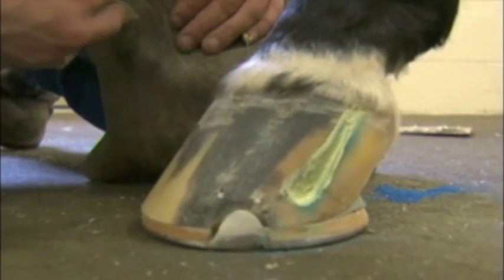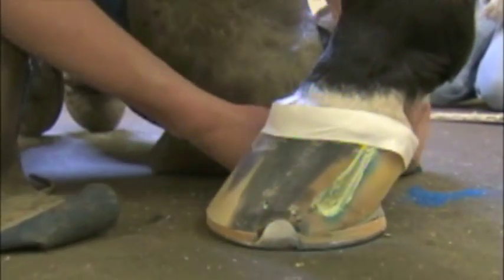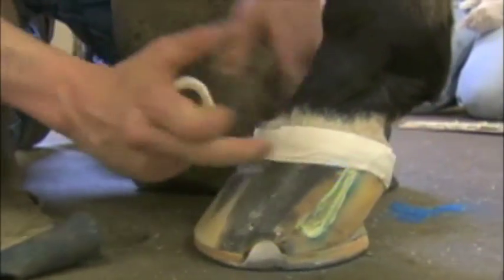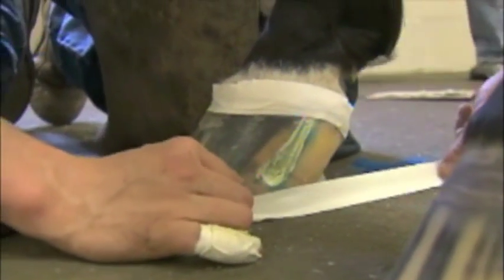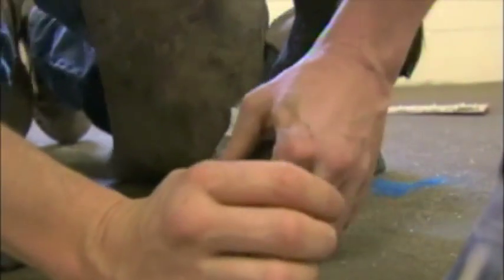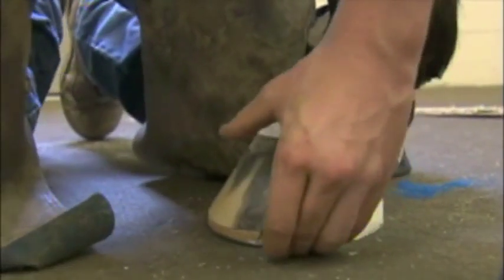I'll use some tape just to cover up the coronary band so we don't get any glue on the coronary band. I'll also put a little bit of tape on the shoe as well — I don't want any glue on the shoe in this case. We're just patching the crack, so we'll block off what we don't want covered with glue.